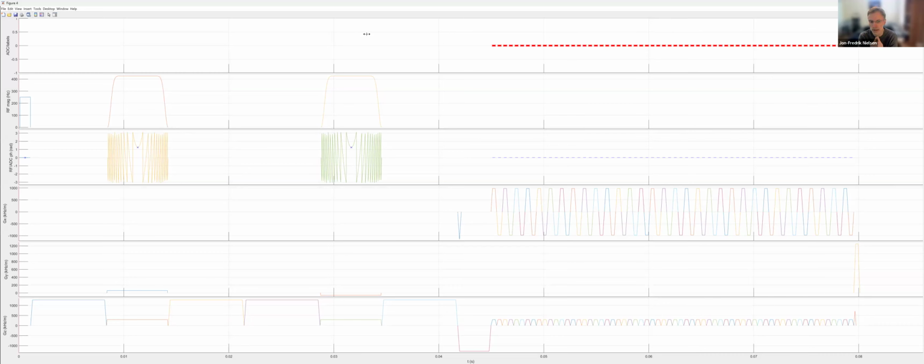But once you have the event, it's extremely flexible. Yeah, using the extended trapezoids, extremely flexible. So you can look at what you have. If it is what you want, then add block will put it in for you. Add block has been, as far as I can tell, extremely robust.